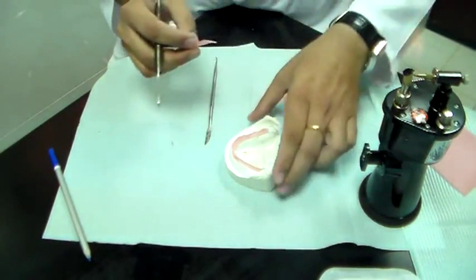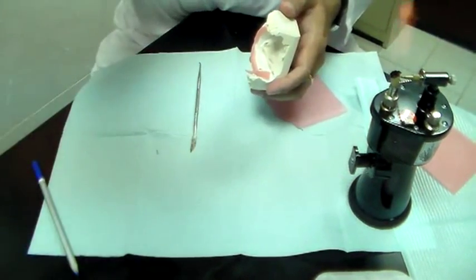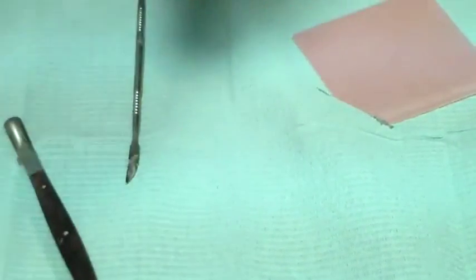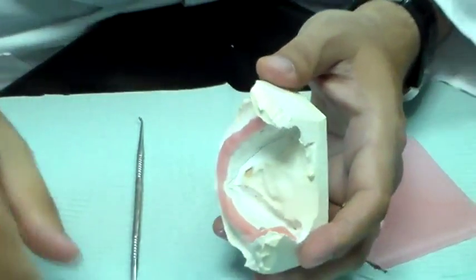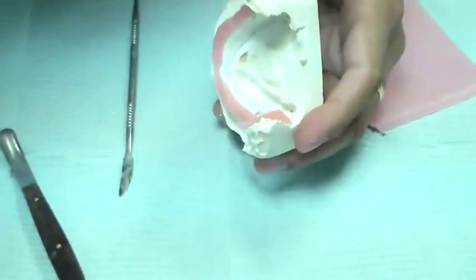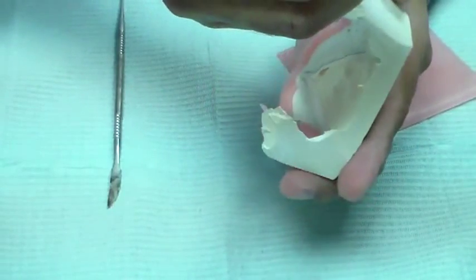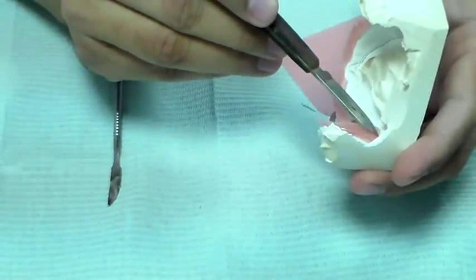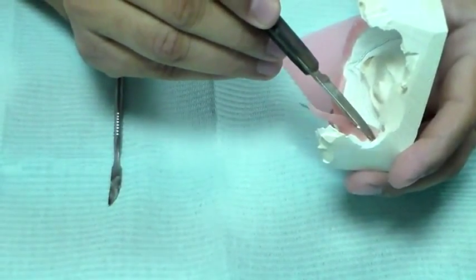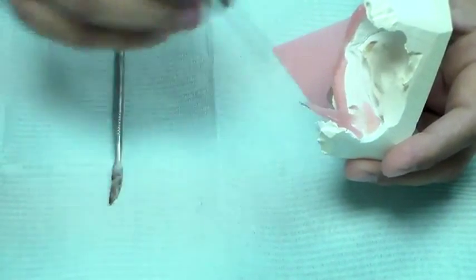I've got my wax. I'm going to place some here and bring it in a bit so you can see what I'm doing. I'm going to heat up my instrument and very gently melt the wax into that position. I just want to give it a little bit of relief.